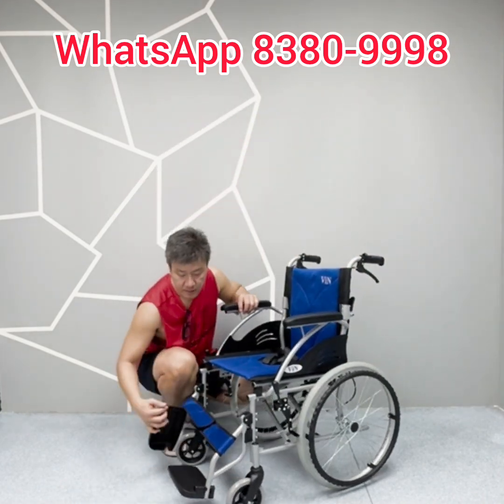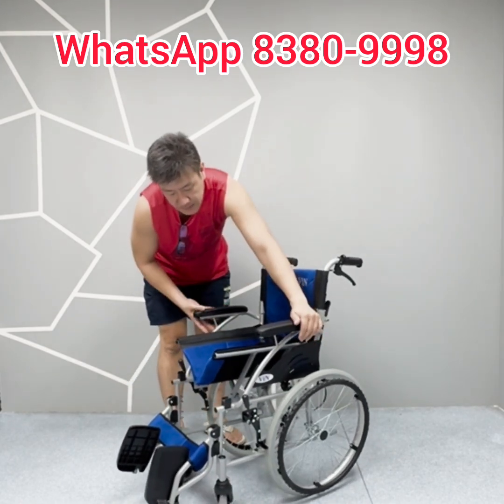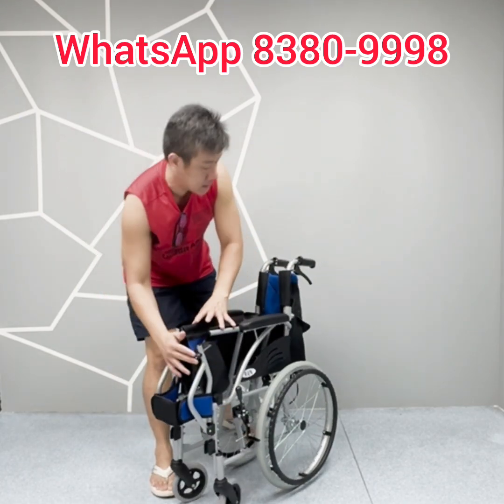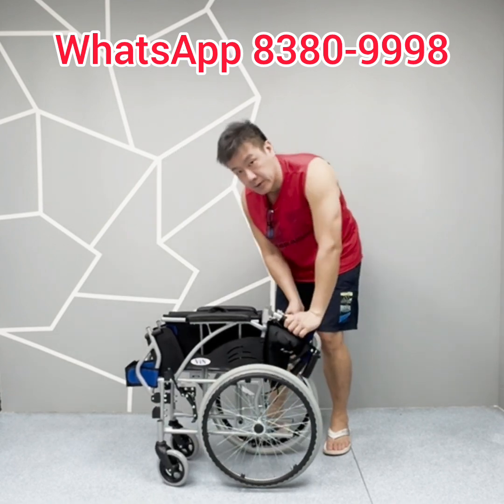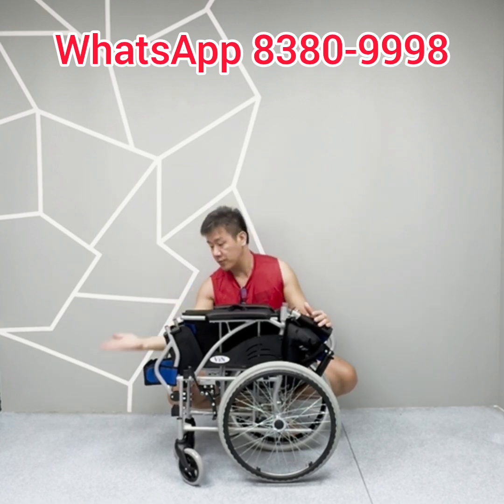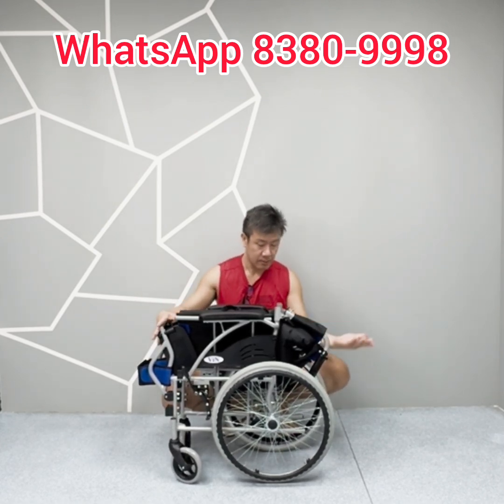To close this wheelchair: flip up the footrest, lift up the seat and close the wheelchair. It has a retractable footrest for compact keeping — press the lever, press down the push bar. Lightweight at 11 kg and compact, easy to keep in the car boot because the footrest is retractable and the push bar can also be flipped down.